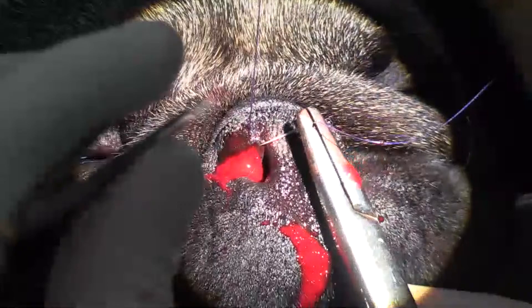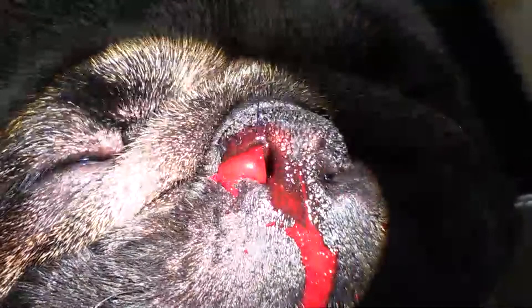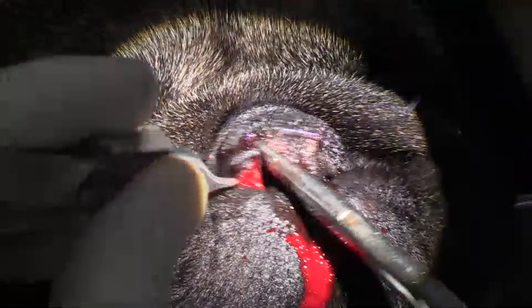The suture that I'm using is 4-0 PDS. The sutures are probably going to be sneezed out before they absorb, and we don't normally actively take these stitches out.